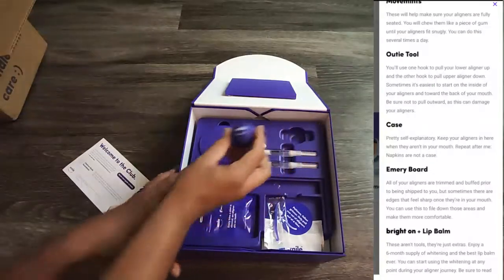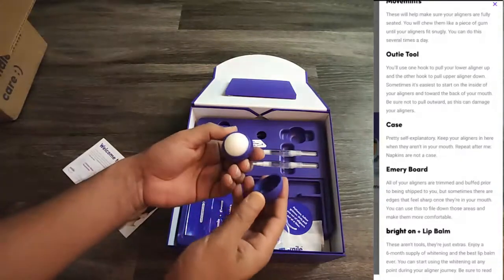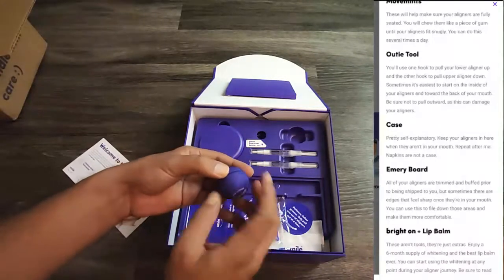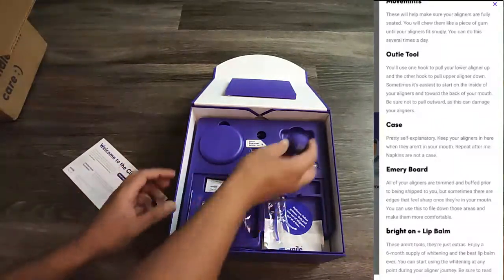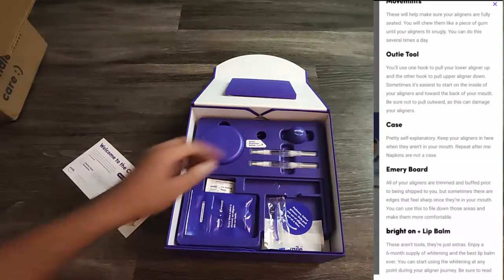When you wear and remove aligners frequently, your lips can become dry, itchy, and cracked. That's why they've included a lip balm, which is a very good idea — it smells nice. I'll put the lip balm back now.